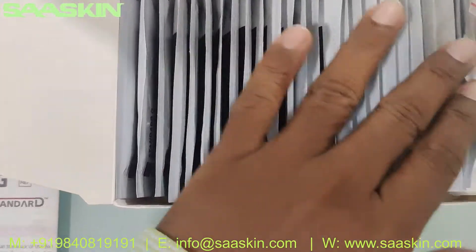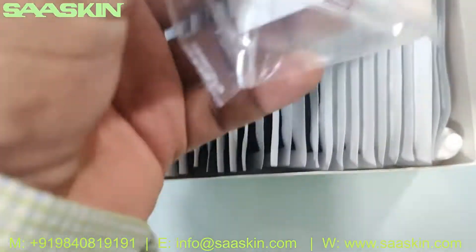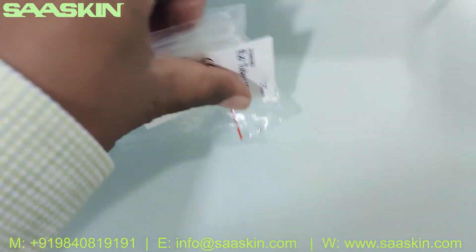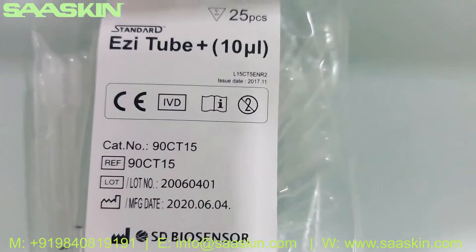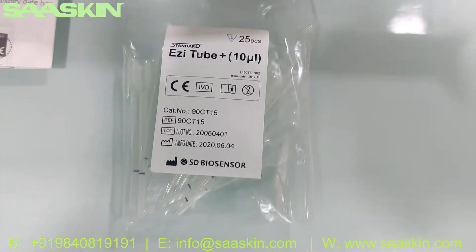Here inside the box you can see 25 numbers — 25 pieces of Ezi Tube. Here in the box, you get the 10 µl Ezi Tube.